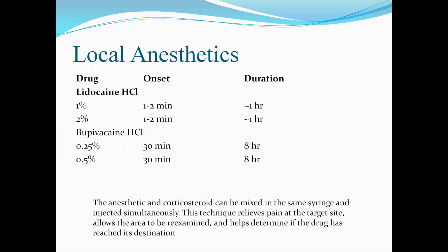So some people also go for a cocktail, adding both the drugs together, so that the lidocaine will give you an immediate effect and bupivacaine will give you a sustained effect. The anesthetic and corticosteroids can be mixed in the same syringe and injected simultaneously. This technique relieves pain at the target site, allows the area to be re-examined, and helps determine if the drug has reached its destination or not. If the pain is reduced immediately, that indicates the drug is perfectly deposited in the right place.